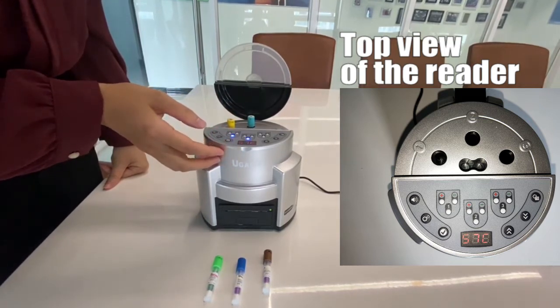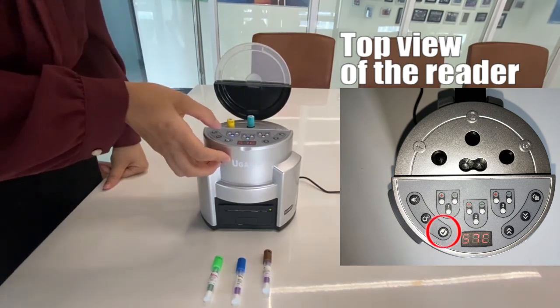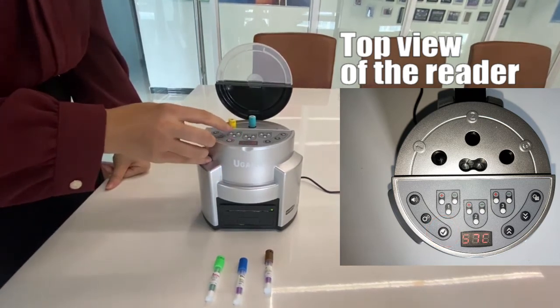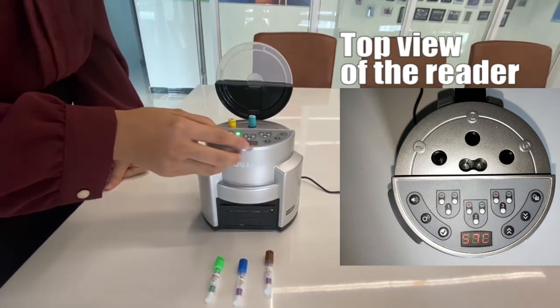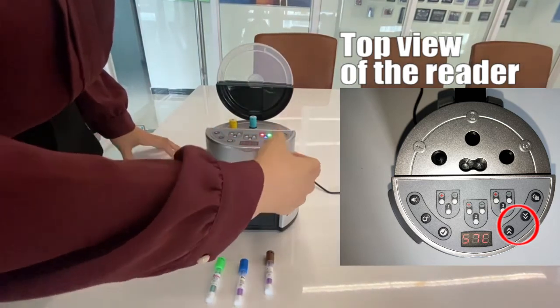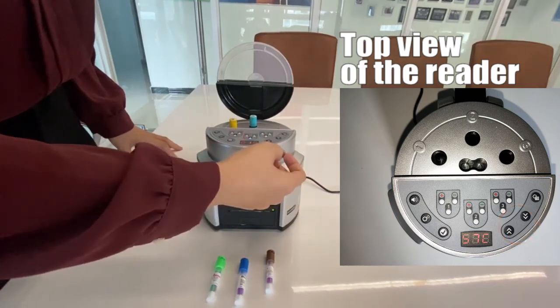If you want to check how many minutes are left for this incubation, press here. This shows the number one slot countdown time — it's 19 minutes left. Press here to choose the other slot. It's very simple.